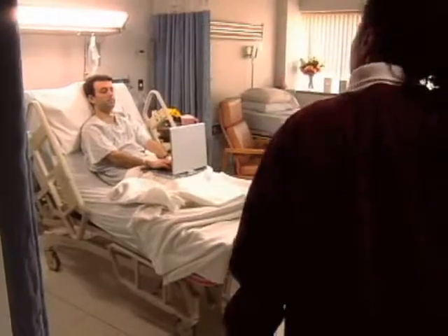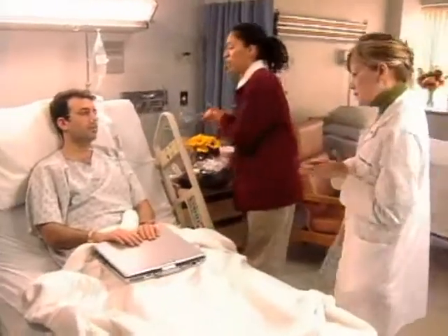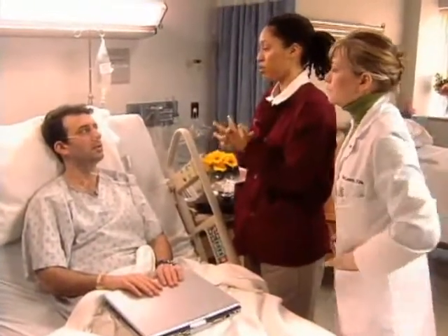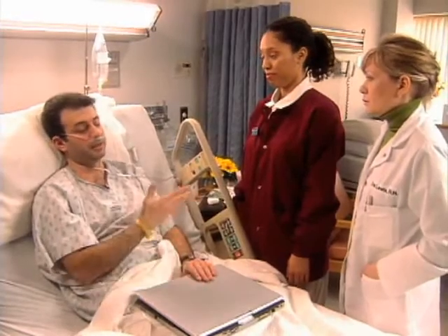Hi, Mr. Simon. This is my nursing instructor, Miss Lewis. Hi. Your doctor wants us to change the way we're giving you oxygen, so I'm going to put a face mask on you, and this is going to give you more oxygen and help you breathe easier. Okay? All right. I guess if you spoke to my doctor, I will.